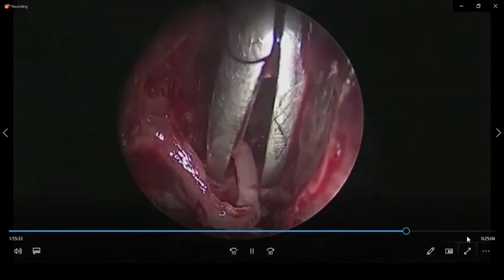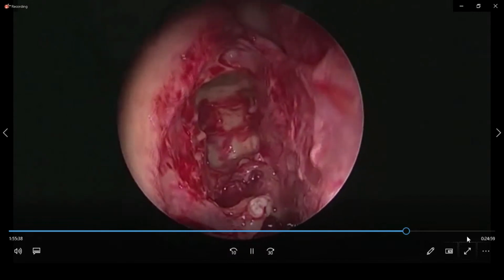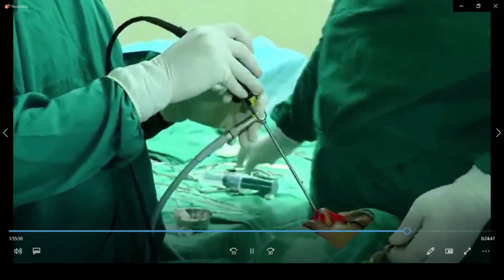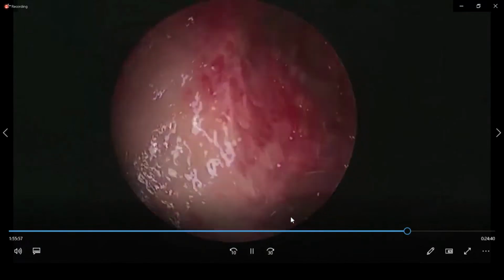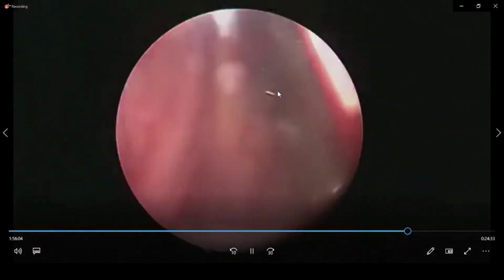That's the beauty. So in the intact bulla technique, as long as you keep the bulla intact, your anterior ethmoidal artery is automatically protected. And that's one of the best ways to protect this artery from getting injured by the surgeon. So you just dismantle the bulla, remove the bulla. Once you fracture it, it's garbage. It's still with a 70-degree. See, this is the middle meatal antrostomy, part of the inferior part of the bulla there.